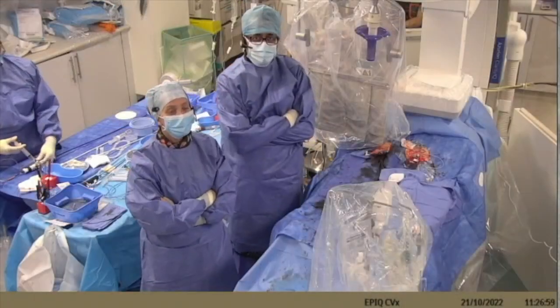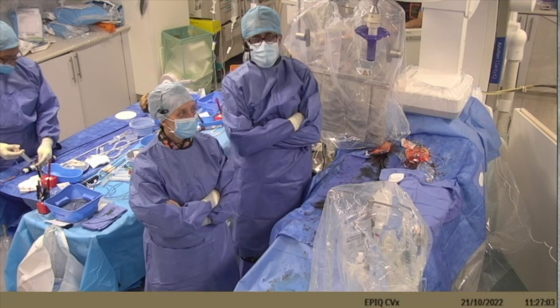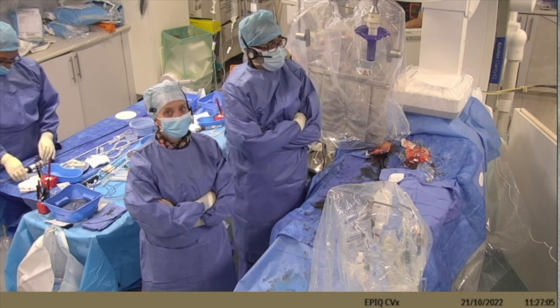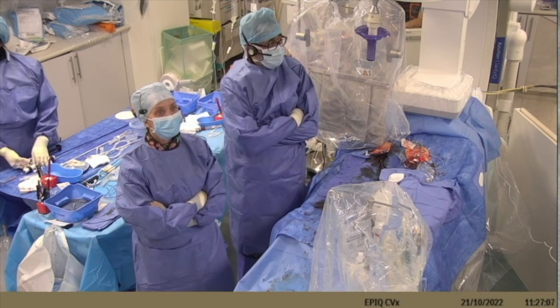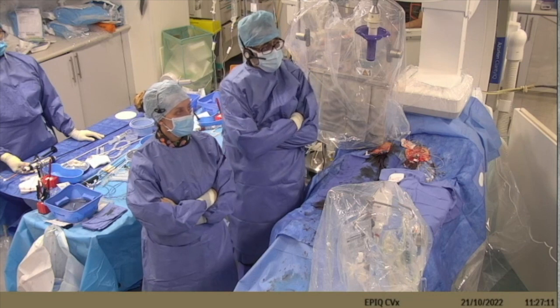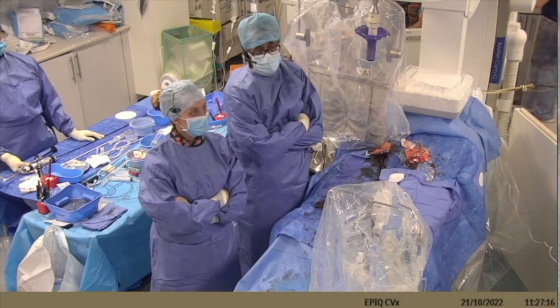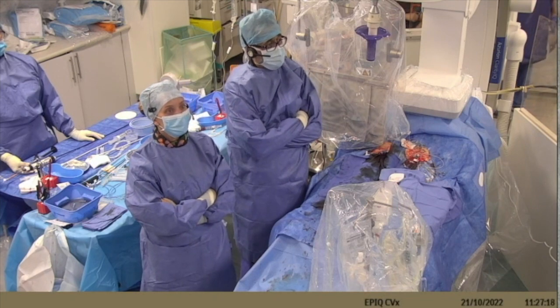And we have a case of mitral valve-in-valve TAVI, really as an emergency. Came in with heart failure, BNP of 12,000. That's been cleared up. If you look at the 3D echo, the mitral valve's hardly moving. And it's amazing that she's not even sicker than she is. So I think we did an emergency MDT. We've agreed that this will be a valve-in-valve TAVI.